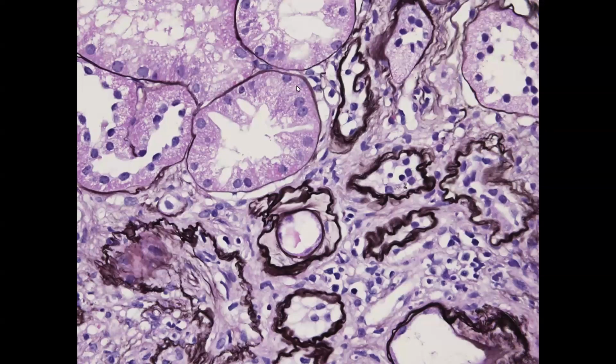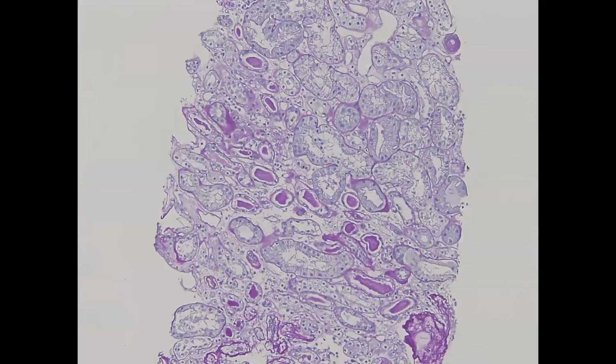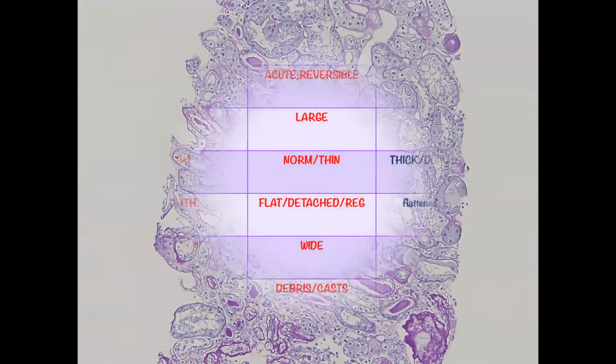There is marked vacuolization inside the cells, indicating the presence of injury or acute tubular injury in addition to this tubular atrophy, not astonishing to be present together. This is the endocrinization form of renal tubular atrophy. And this is the thyroidization form of renal tubular atrophy.